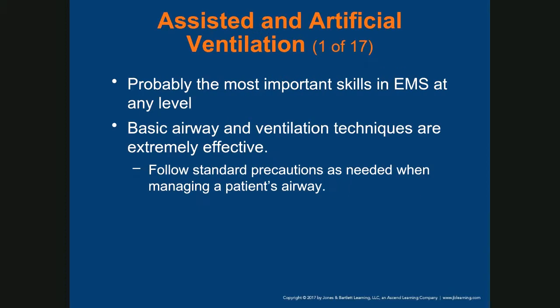Now, assisted and artificial ventilation. Whether you use the term assisted or artificial ventilation, it means that you're providing positive pressure ventilation for the patient, right? Now, probably the most important skill in EMS at any level.